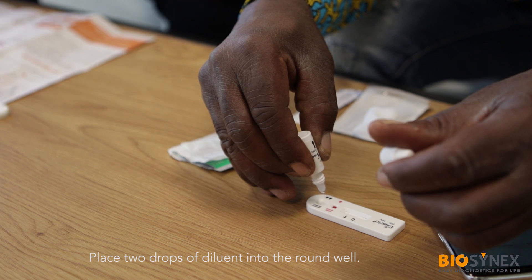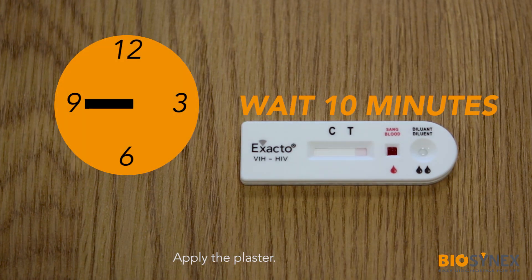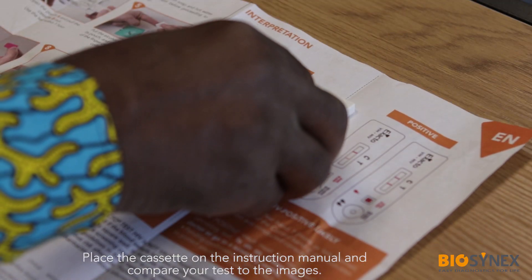Place two drops of diluent into the round well. Wait 10 minutes before reading the results. Be careful not to wait longer than 20 minutes. While waiting, apply the plaster provided to the punctured area.